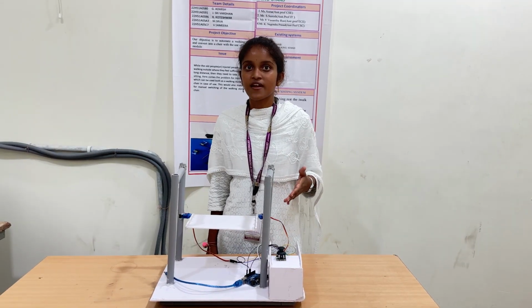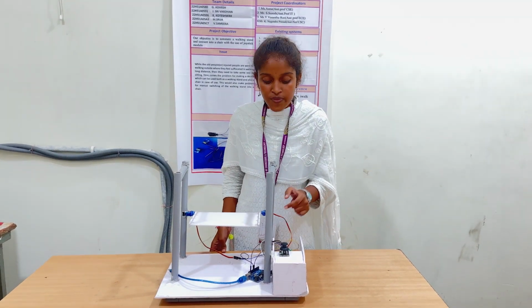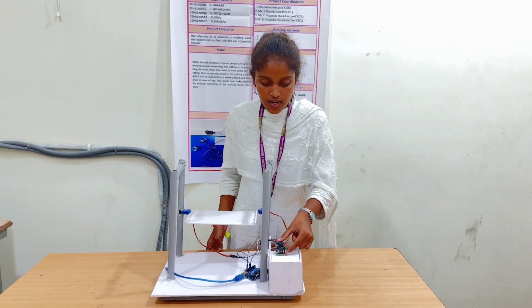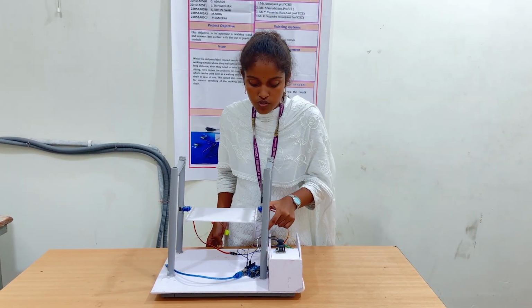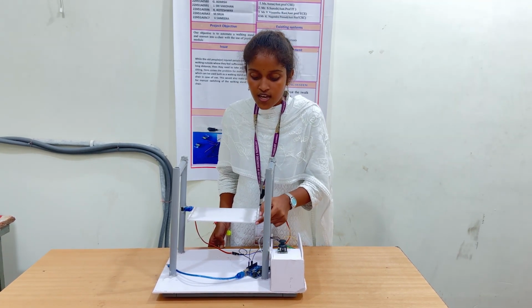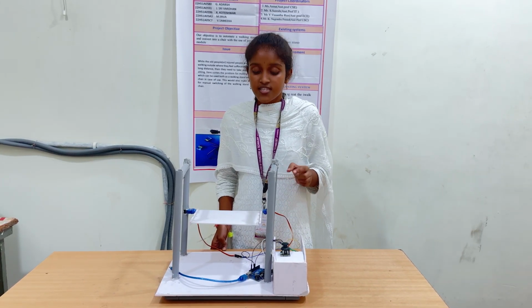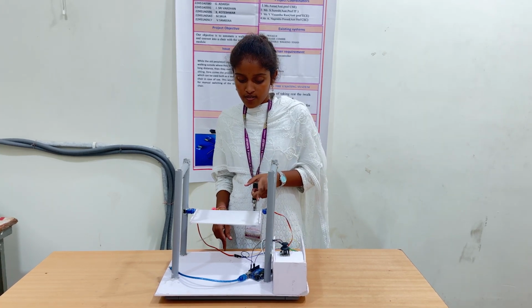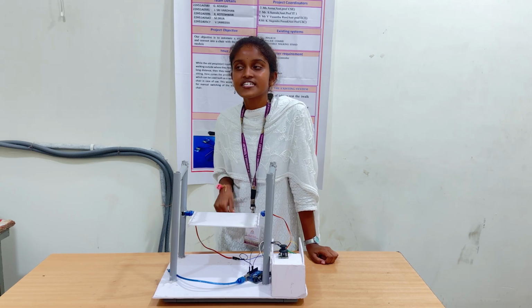Now I am going to explain the working. First we have to upload code to the Arduino, and we have to give input from this joystick. If we give input to this joystick, this input goes to the analog pins in Arduino, and through digital pins the output comes to servo motors. Then the servo motor rotates. This rotation of the servo motors is able to do the opening and closing of the seat.